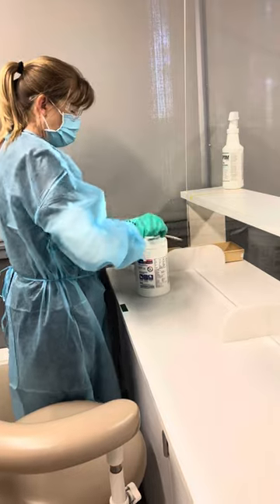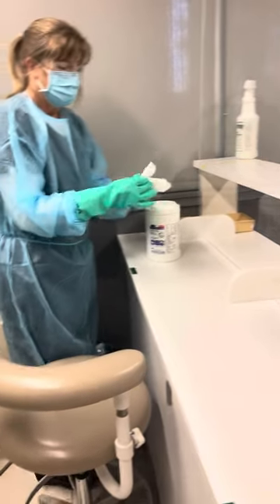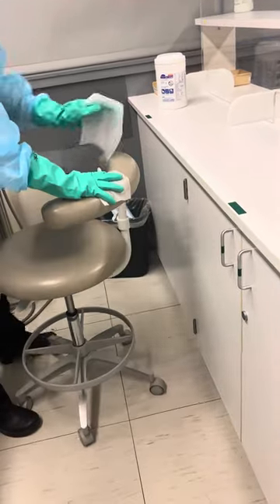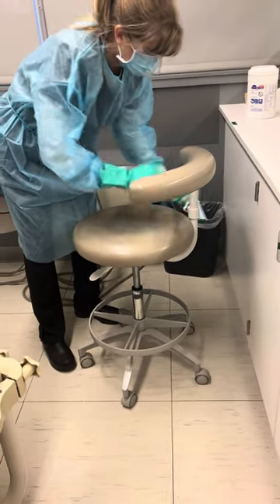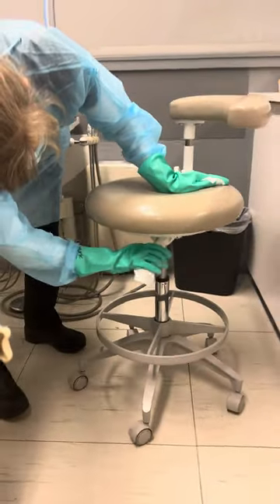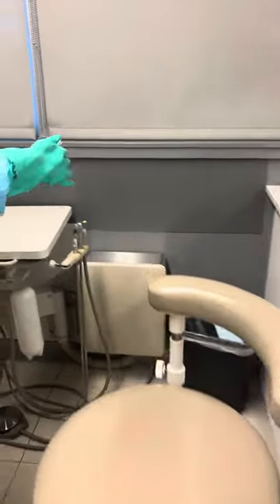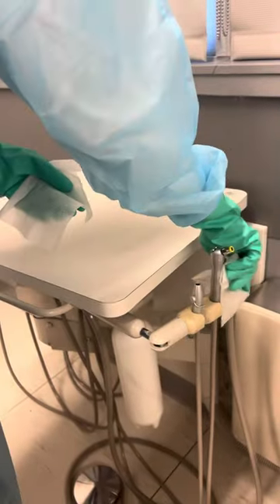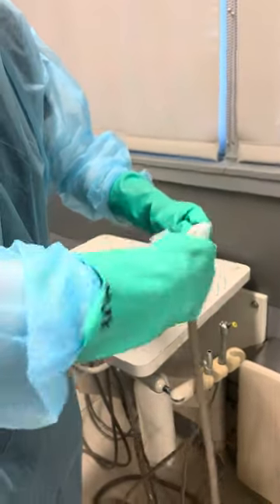She's going to grab two wipes — always two wipes. The assistant chair had no barriers on it, so she's going to wipe: holding with one and wiping with the other, wiping the whole thing down. Don't forget the handle because we might have adjusted it.